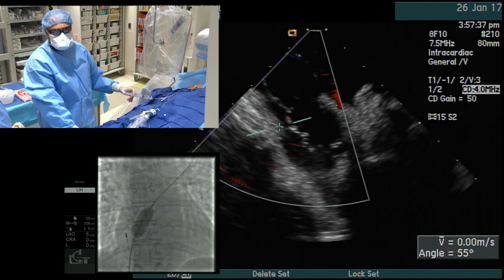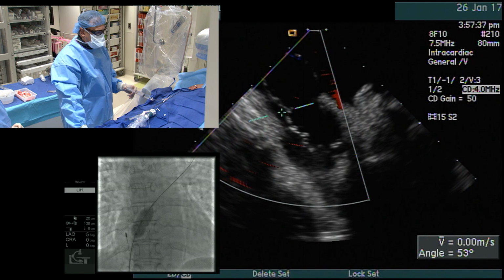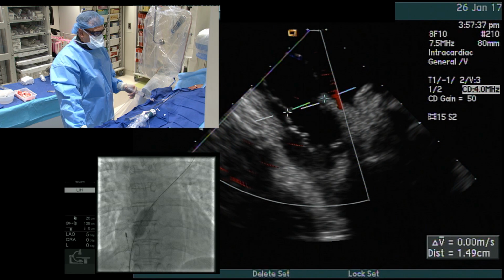The foundation anticoagulation for the patient is heparin, and we like to keep the ACT around 250. See how it just goes in? That's the standard procedure. So I want that cross mark right there. Go up, go up, that's it. Okay, click it, and then you're going to go out here. That's about right. So what do we have there?